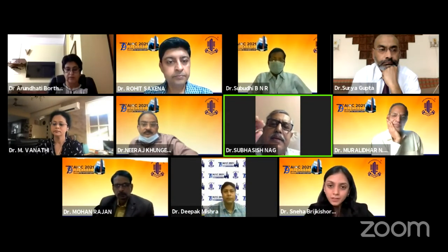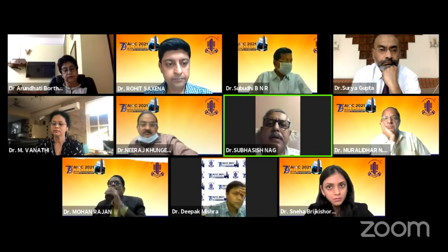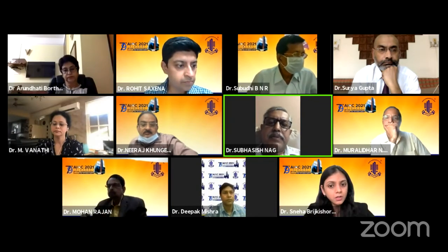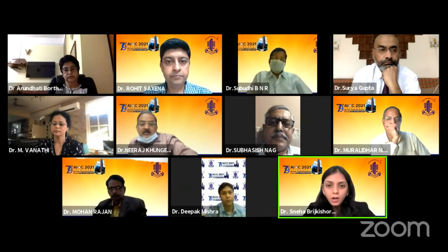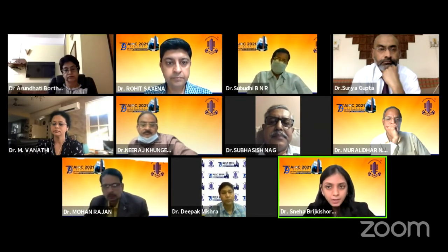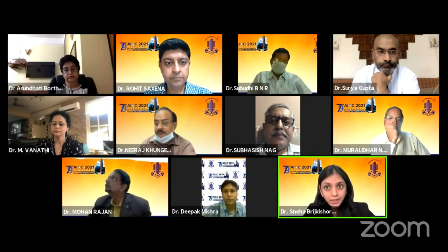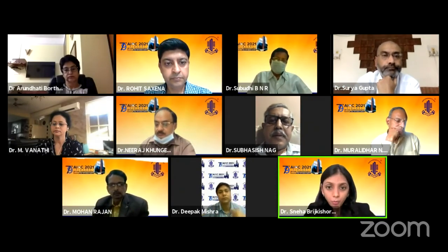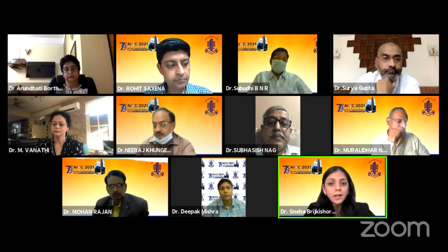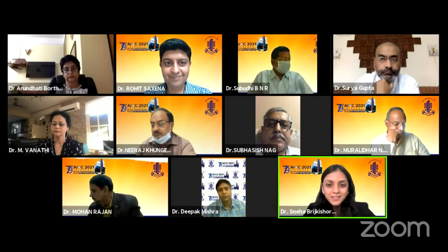And another thing, any difference in the group of patients? Suppose the ectasia is more in a group. Do you find reliability problems or some other differences? Currently we have a patient who was planned on Accusimics, and has now come after 2 years of follow up, and we are planning very cautiously. For the patients who had developed ectasia, we worked on it retrospectively, and we found that they were in the right extreme of our Accusimics report. Currently, we are going very cautiously over it, and we pray for no more surprises.